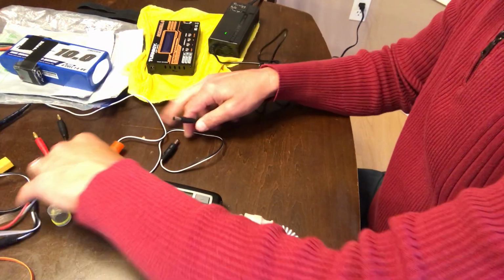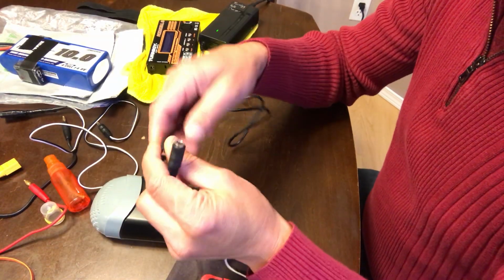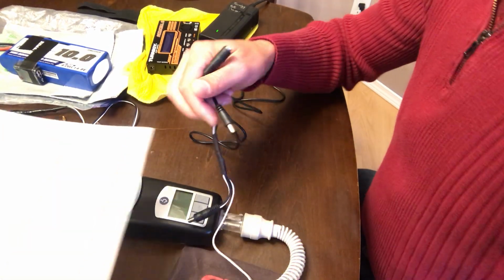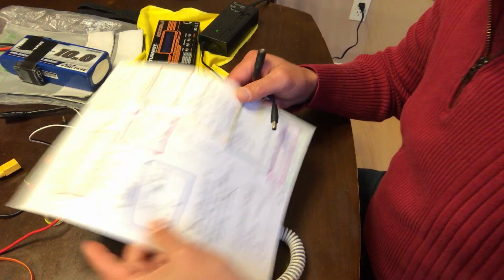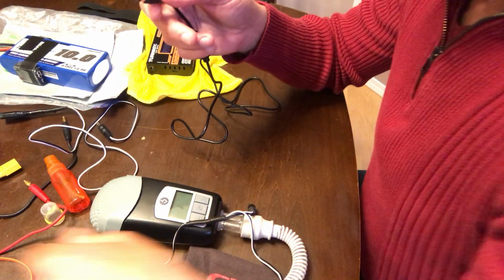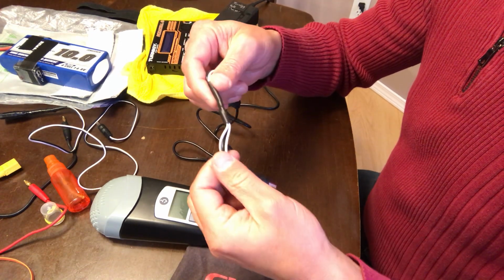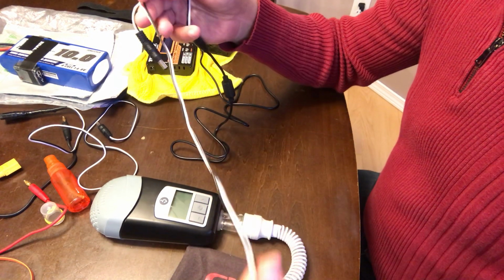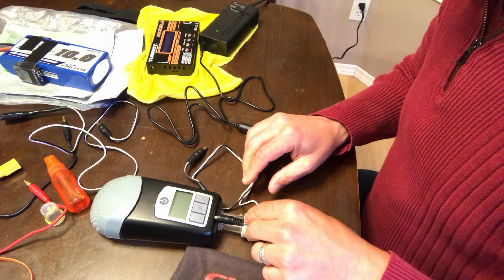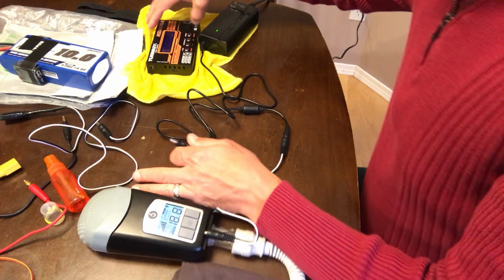And what I did is I created this little splitter, this one here. So I had to figure out the barrel size of this barrel, and this barrel, according to my paperwork, has a 5.5 millimeter barrel, and this one had a 5.2. So I did a 5.2 female and spliced on 2 different units. So this one is my 5.5, and this one is my 5.2, which goes to my charger.